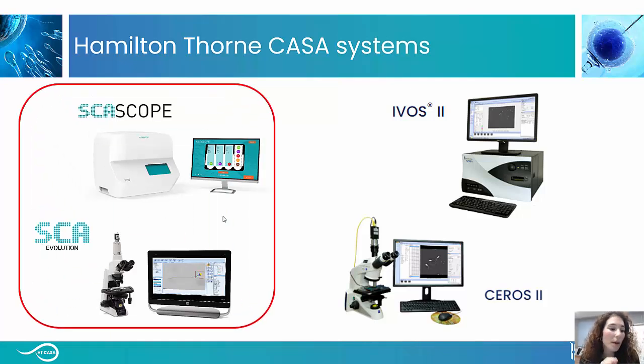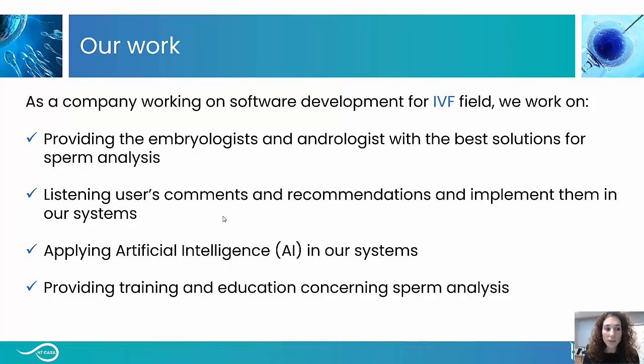So today we are mainly focusing on the SCA SCOPE and the SCA Evolution to introduce to you the new version. I would also like to take the opportunity to tell you a little bit more about our work as a company that has always been working in the IVF field for more than 30 years.